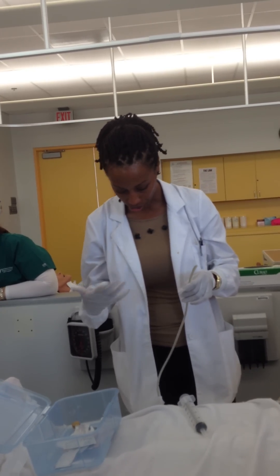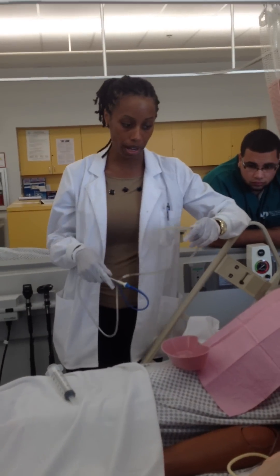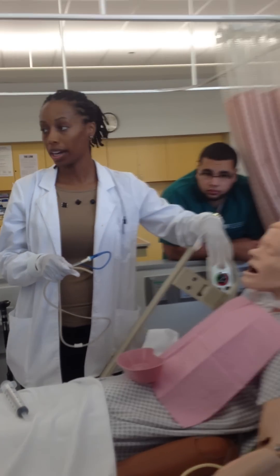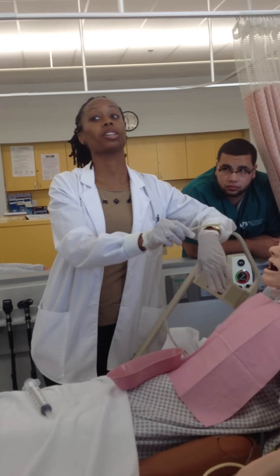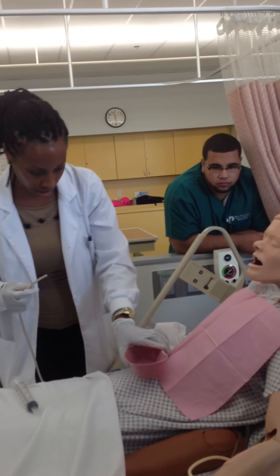What you tell the patient is that you're ready to start. You can ask if they're ready or just tell them, okay, I'm ready to start. What I need you to do is lay back and relax — you want their head back. Naturally, when you start to go in, they're going to pull back because they don't want you going in their nose. So you have it lubricated.